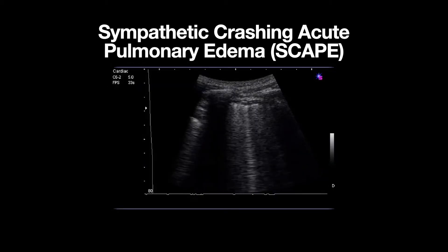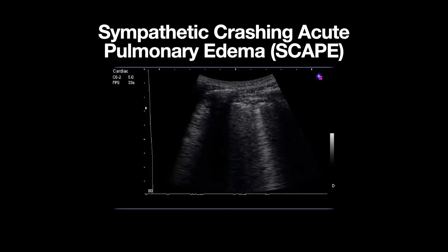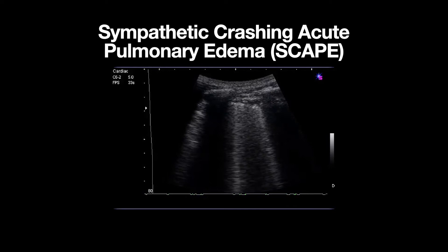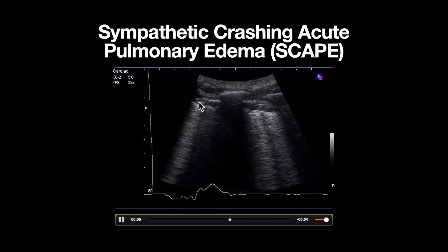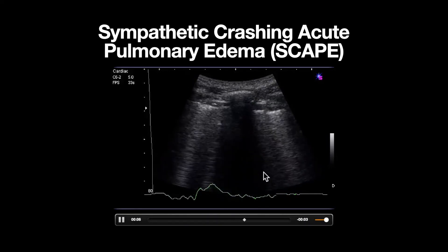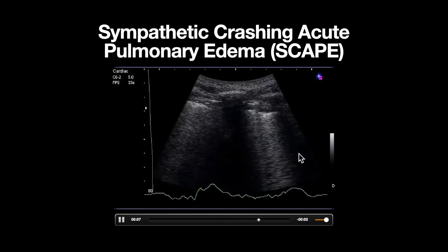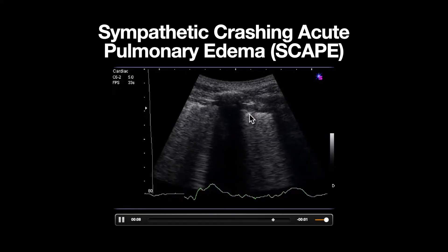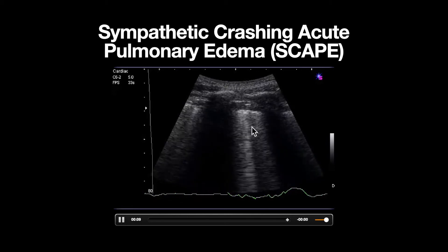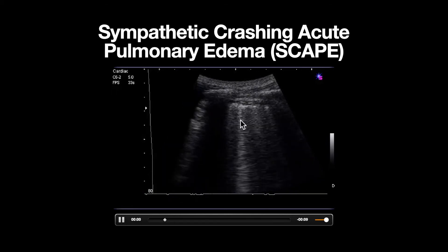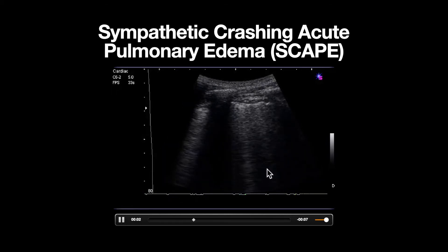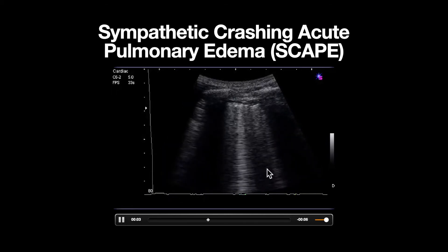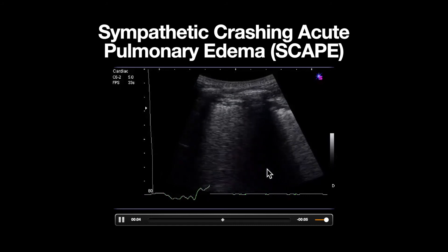An exemplary image of the patient's lungs can be seen here. We have rib shadow, and our pleural line can be seen here with diffuse B-lines seen throughout multiple intercostal spaces, suggesting an interstitial syndrome.